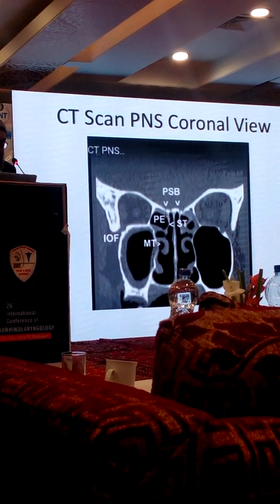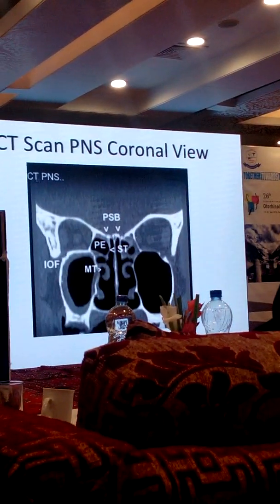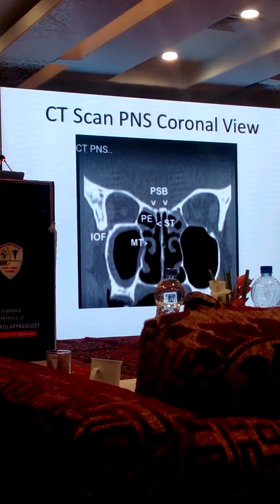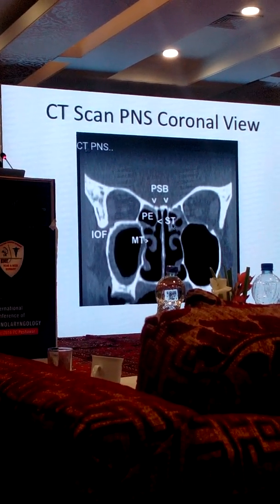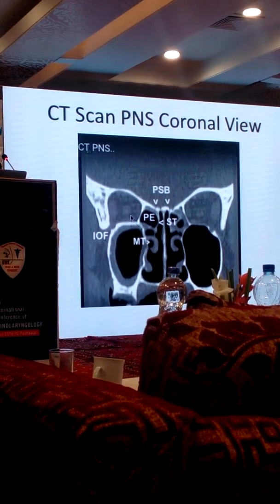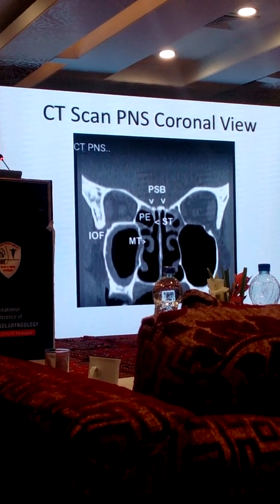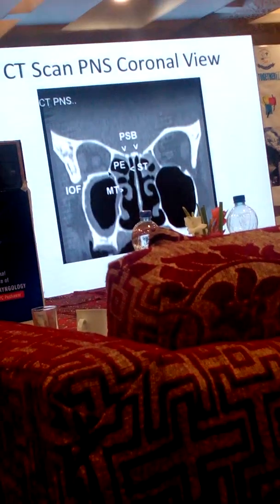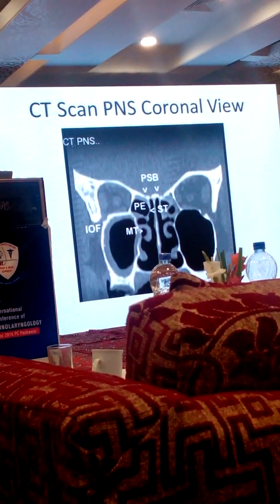Now as we go posteriorly, it is becoming flatter. The posterior skull base has become flatter. Posterior ethmoidal cells. Again, superior turbinate. In this orbit, we can easily identify the optic nerve and the four recti. Initially I forgot to mention, we can even identify the superior and inferior oblique muscle.